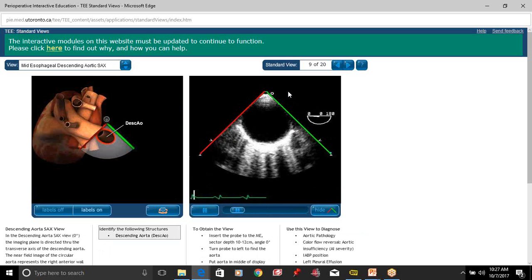so another important view is to look at the aorta, the descending aorta, because one of the requests for TEEs is to rule out aortic dissection, where the wall of the aorta rips. So you have to look at this view. I usually, after I get my gastric view, then I straighten the probe, rotate it to 180 degrees, so it's either 0 or 180, and you get your nice cross section. There's a short axis view of the aorta. You can see the wall of the aorta. Okay, so if the wall is ripping, you can see it easily.